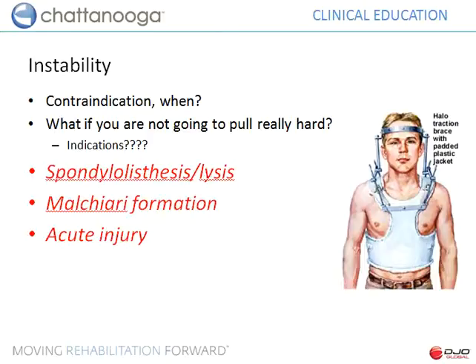So spondylolisthesis, spondylolysis, for example, has been a contraindication. Now, if we consider today's technology, today's devices, so I've already outlined the fact that we can use very low energy densities, and I can actually start to apply tension to tissue even before I start to see large amounts of mobilization in the joint structures.